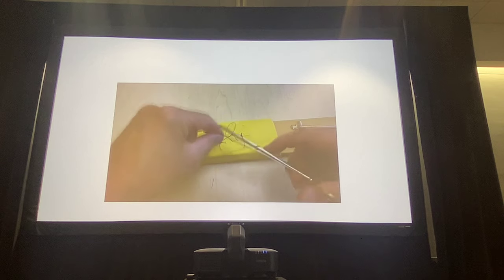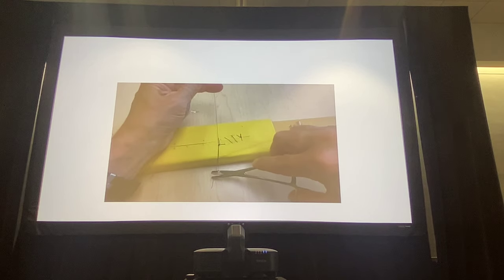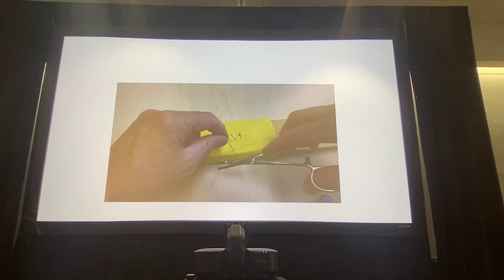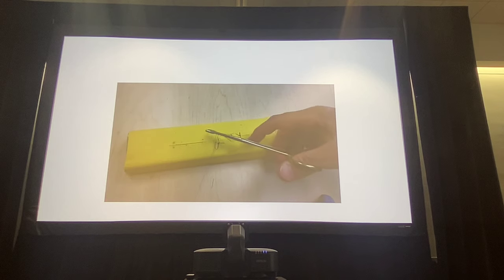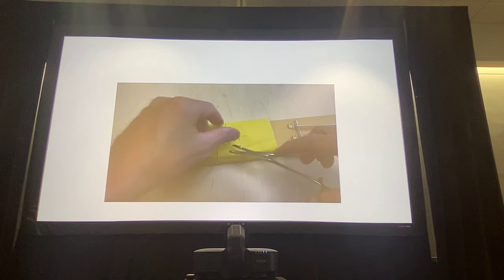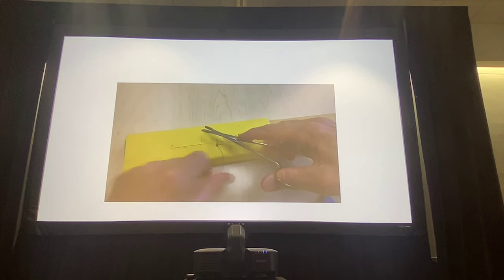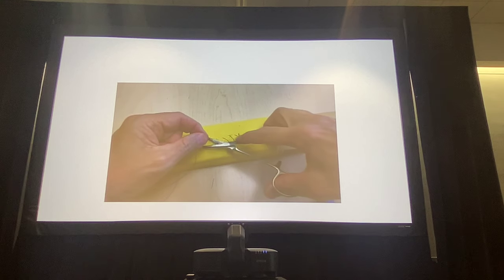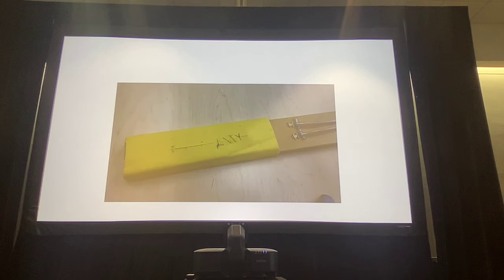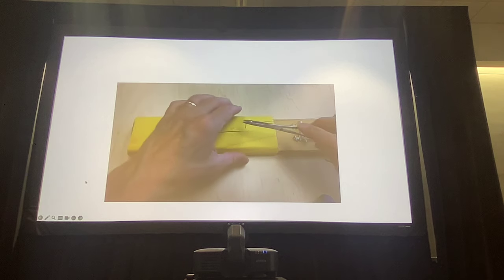To end this suture, some of you might find it pretty intuitive how to end it. It does look a bit weird because you're going to end with a loop at the end. So I'm going to play the video again, and whenever you're ready, focus on how he ends the closure. Besides the loop being there, everything else about ending this continuous pattern is the same. Surgeon's throw, then square knot, square knot, square knot. But it looks a bit intimidating because you've got that loop there. So I'm going to play the video again, and we'll see how you guys are doing.